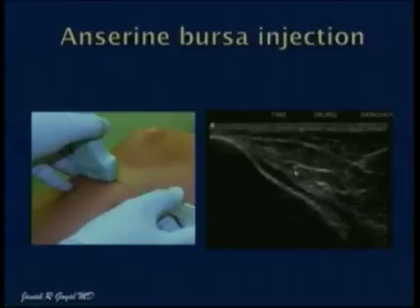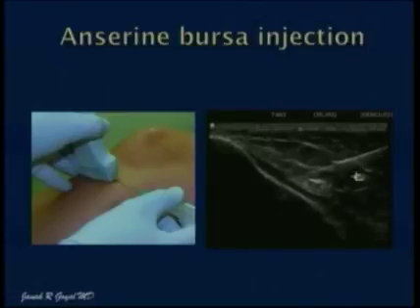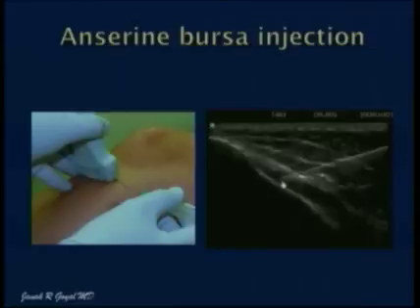Anserine bursa injection. First I define my anserine bursa and go on the longitudinal plane of the anserine bursa and direct my needle in plane into the bursa for injection. Here's the needle, in plane approach into the bursa.